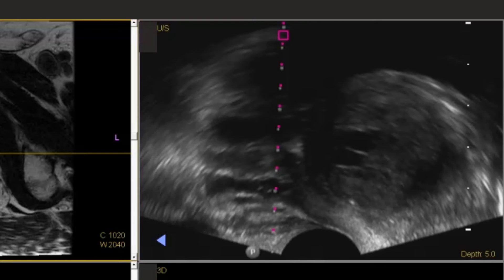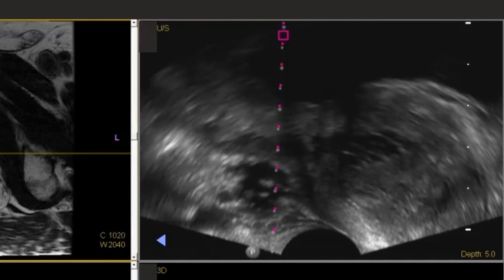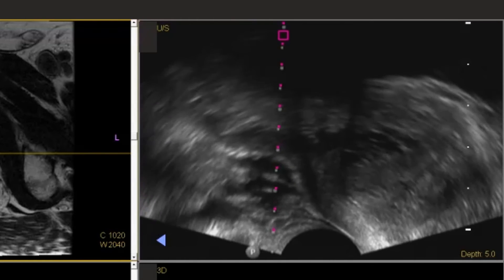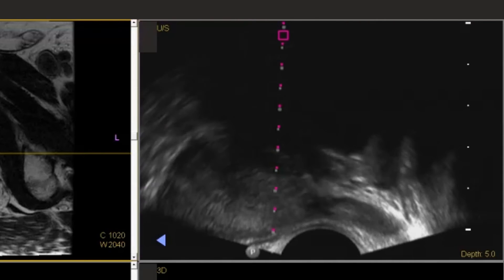And then if I have any lidocaine left over, I sometimes will do additional injection at the midline medial prostate. With this double anesthetic block — which is twice our normal 10 cc block for regular prostate biopsies — patient tolerability has been excellent with very minimal discomfort.